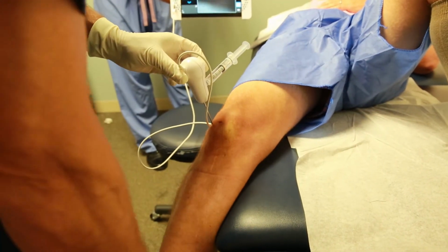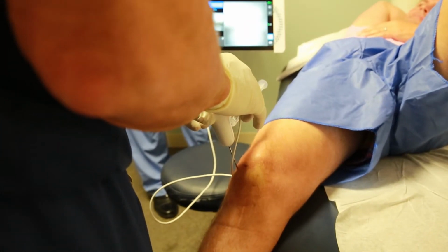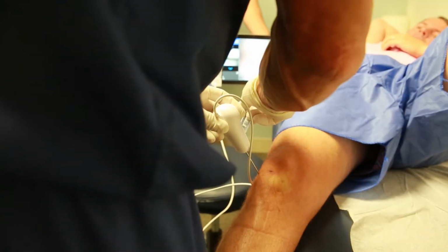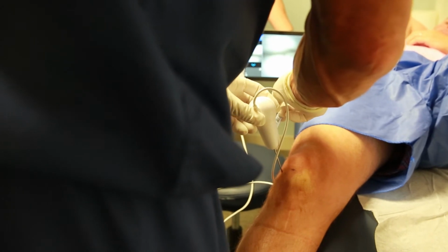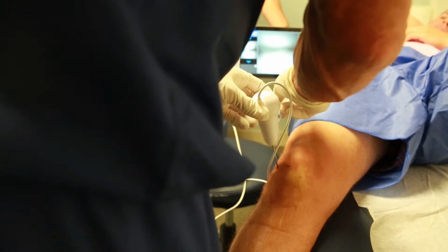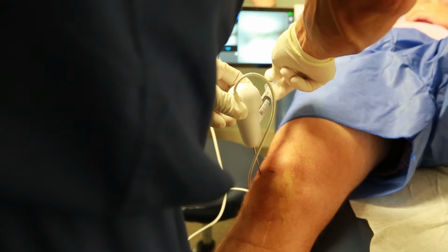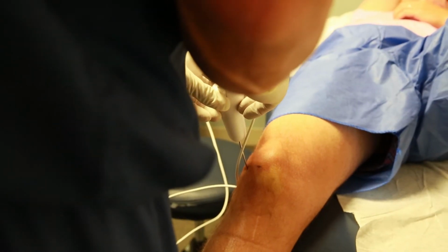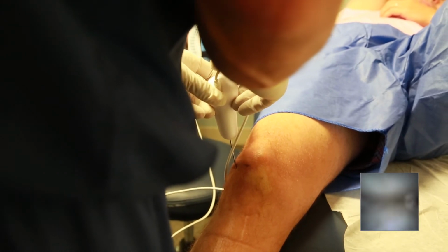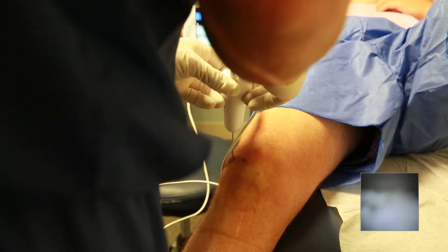I'm going to bend your knee a little more. Crank that open. Now I'm in your lateral compartment. You can see a little bit of arthritis right there. So we have some grade 2 to 3 changes on the outside of your knee, and that's more arthritic change, not overall.